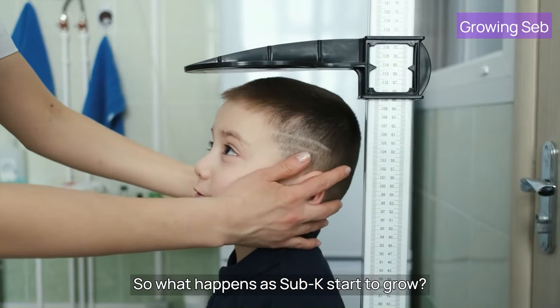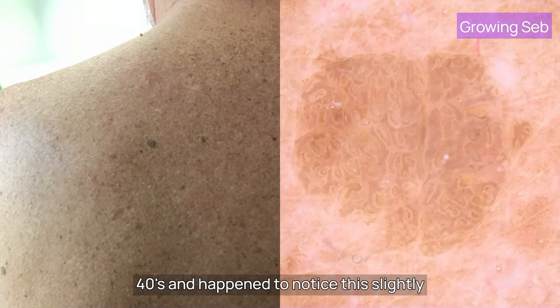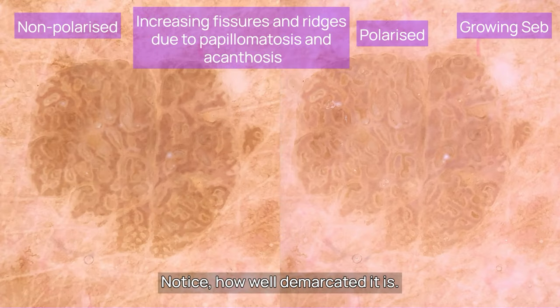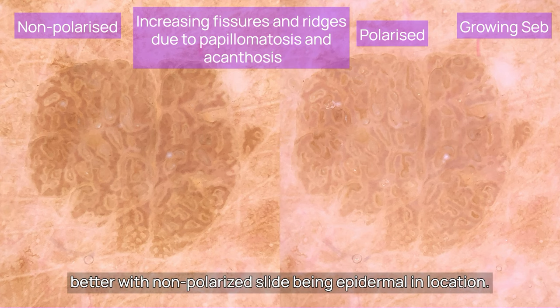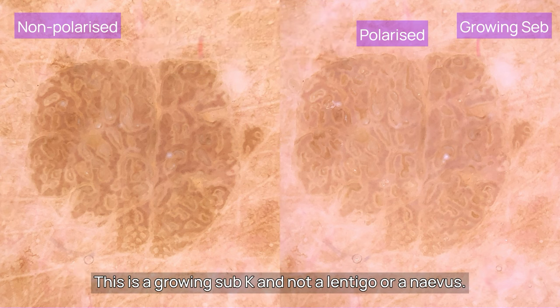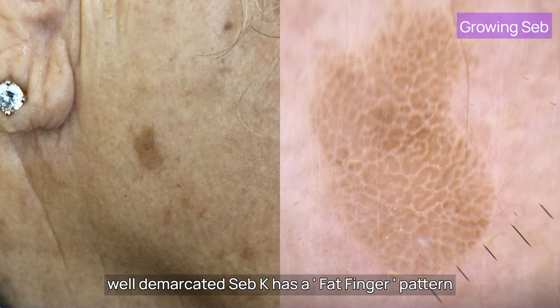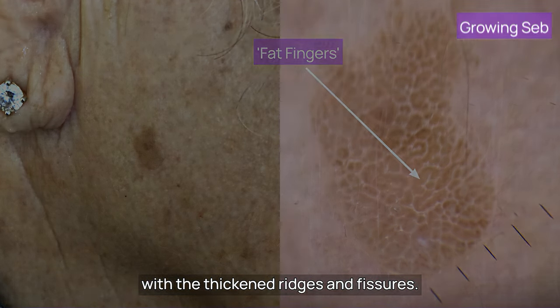So what happens as a Seb K starts to grow? I was doing a skin survey on this chap in his 40s and noticed a slightly raised, tan-coloured plaque on his back. Notice how well demarcated it is and that the fissures and ridges are thicker — seen better with non-polarised light, being epidermal in location. This is a growing Seb K and not a lentigo or nevus. On this lady's right cheek, this well-demarcated Seb K has a fat-finger pattern with thickened ridges and fissures.